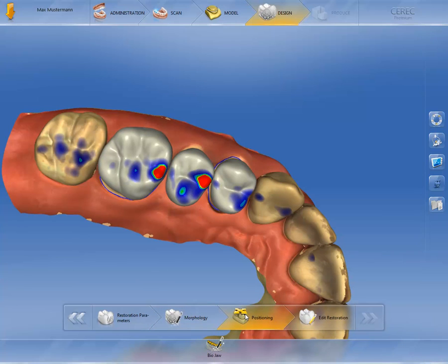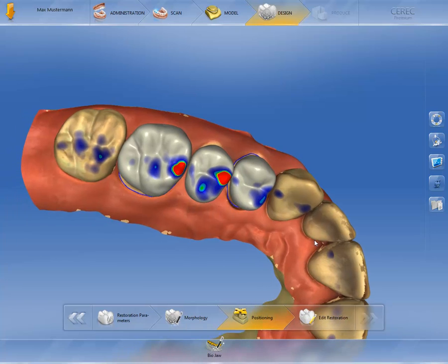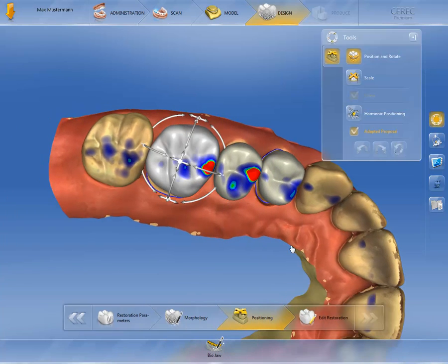Note the colored surfaces. The dark blue and green to red areas show the strength of the contact points. To this end, the tools Position and Rotate and Scale are available.